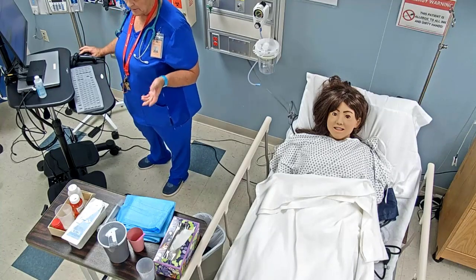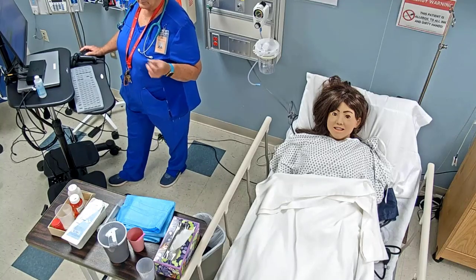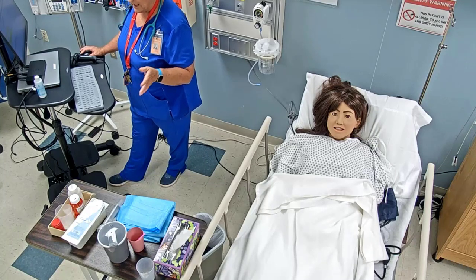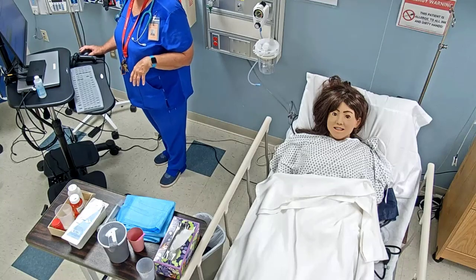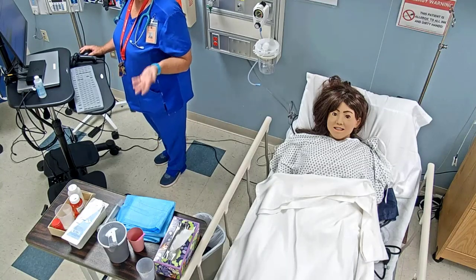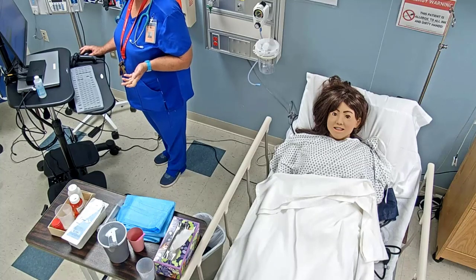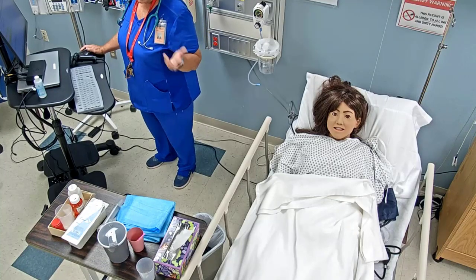With the medications, I'm going to make sure that they can be crushed, especially if it's in a pill form. Now, if it's in a liquid form, it's not a problem, but if it's in a pill form that's not crushable, then we would need to contact pharmacy to see if there was something we could change that to. So checking to make sure that it is, and metoprolol, I think I have one that does, you can crush it. Now, so we talked about I and O, fluid restriction.